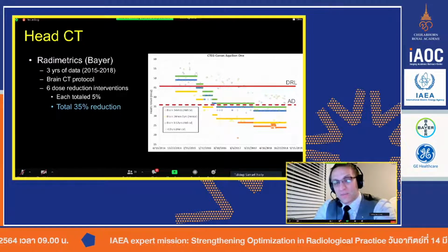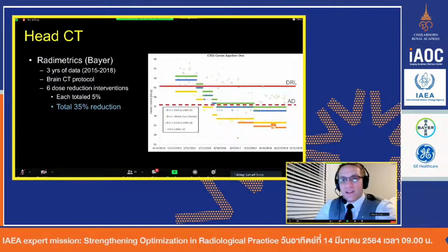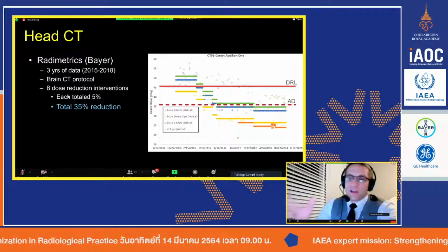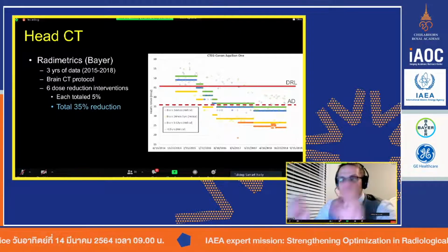And eventually we got to the point where we dialed it down. You actually see there's only 5 lines here, because we actually did 6 interventions, but we realized that 6th one was a little too far. And so we dialed it back really quick. And so that is how we found our sweet spot.